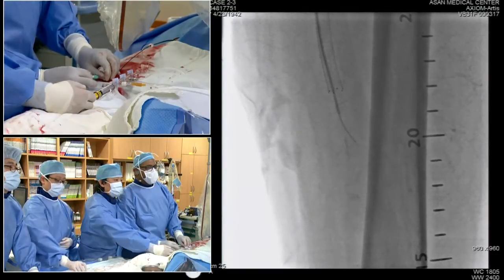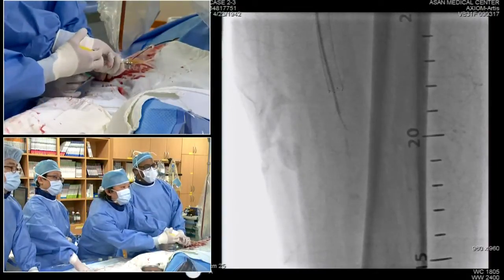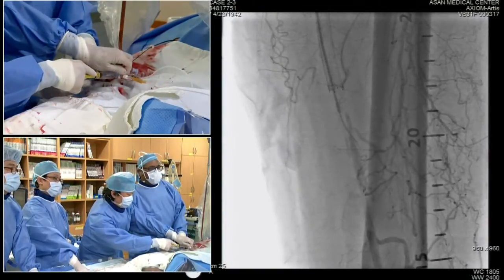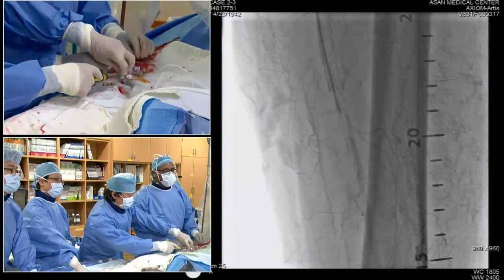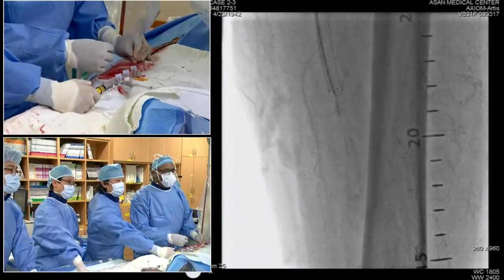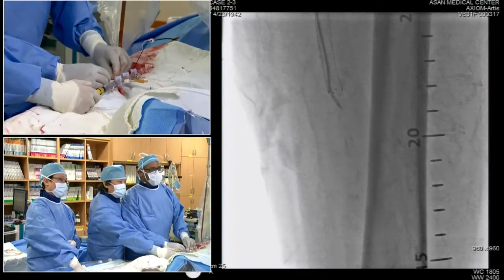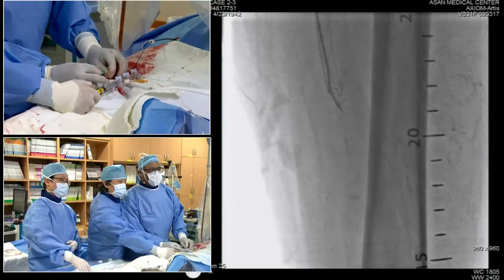So this outcome suggests that that stent was subintimal all along. There was probably a recanalization of a long occlusion subintimally and then spot stenting, and the stent became the subintimal space. So when it reoccluded, that makes it very difficult to recanalize. He achieved the hardest part, which is getting into the stent from above, but now he has to achieve the second hard part of getting into the true lumen distally.